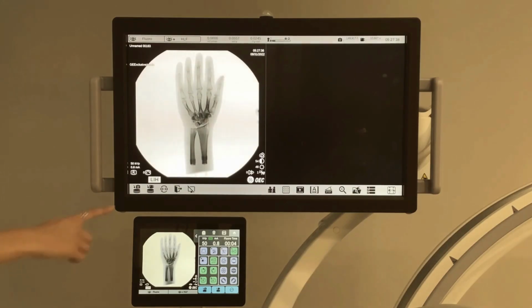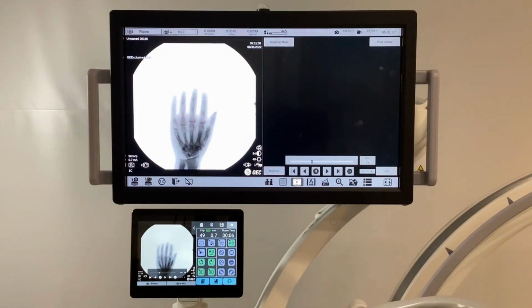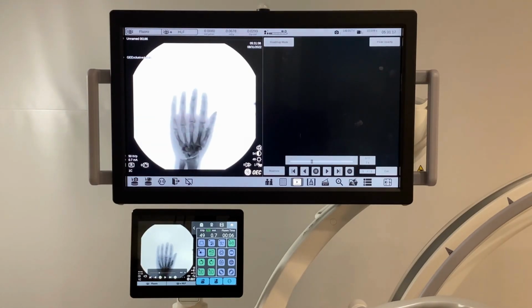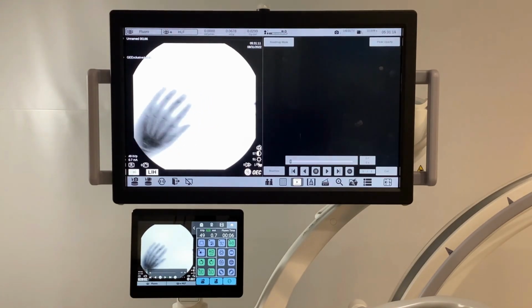Fluorostore is also activated by accessing the Cine Save button on the left corner of the left monitor. Please note, Fluorostore recalls up to 240 frames and is helpful when Cine Record is not set up prior to image acquisition. The Cine Record rate will determine the saving rate. Pulsed exposure saving rate is at a pulsed rate.